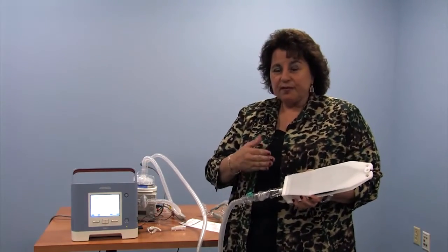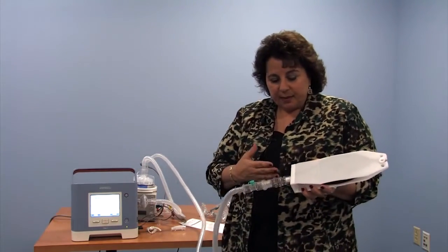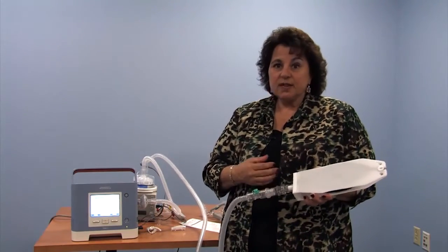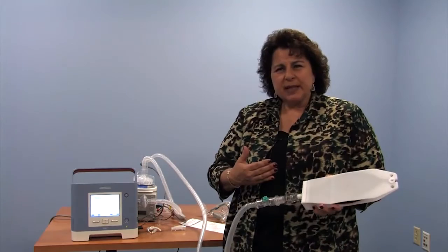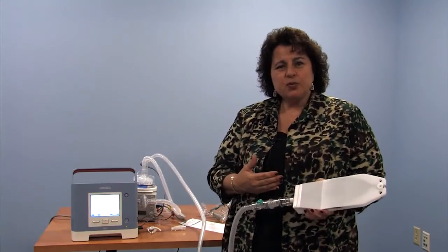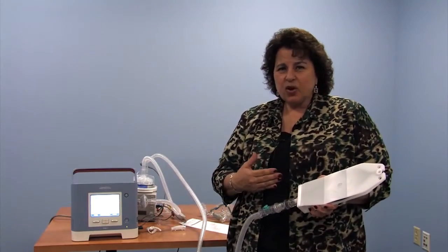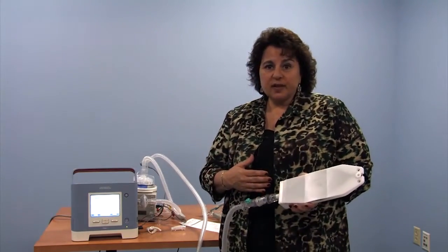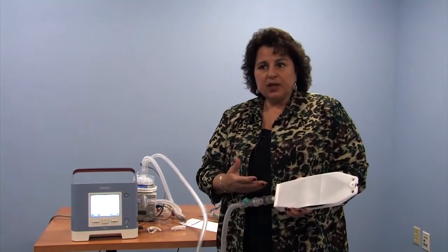It is FDA approved for 5 kilos and above, and can provide the support, and the patient doesn't necessarily have to have a cuff on their tracheostomy tube. If the leak is really large, sometimes we found that the cuff is necessary. But typically the scenario is that a child's home with a tracheostomy tube and maybe has some respiratory distress or pneumonia a few times, and the providers feel, well, maybe we should support this child at night, and we should offer them a little bit of help with their breathing cycle when they're sleeping, because typically we all breathe a little more shallow during sleep, and this child with their breathing problems and/or lung or muscle problems, we think this child probably could use a little bit more help at night.